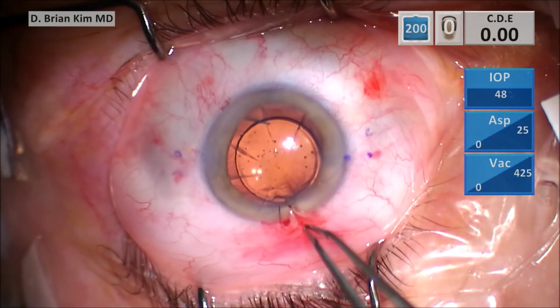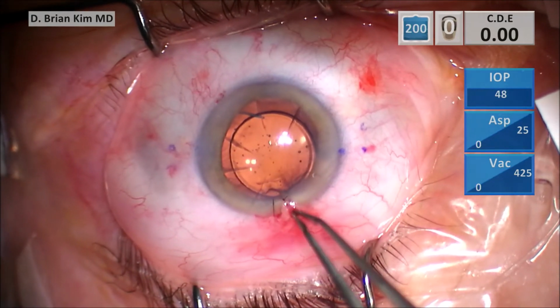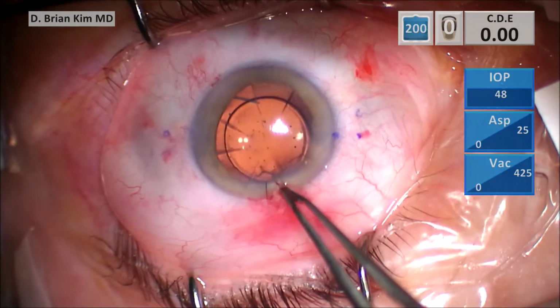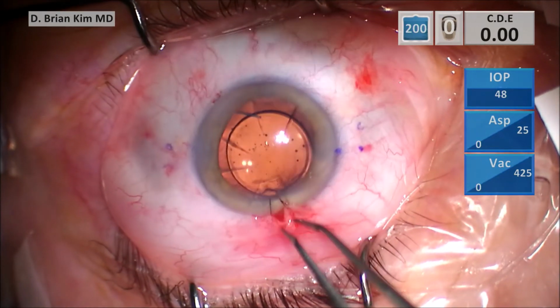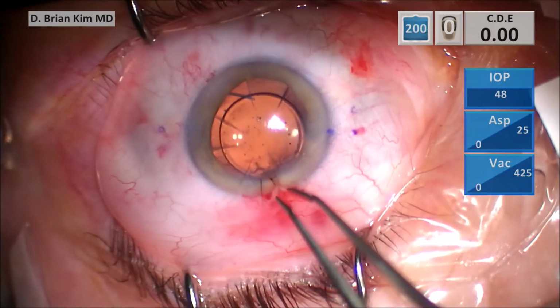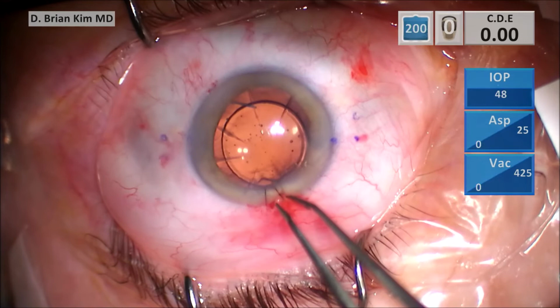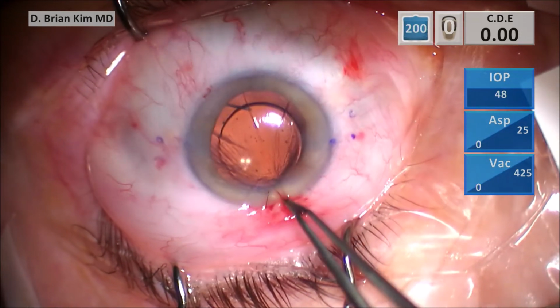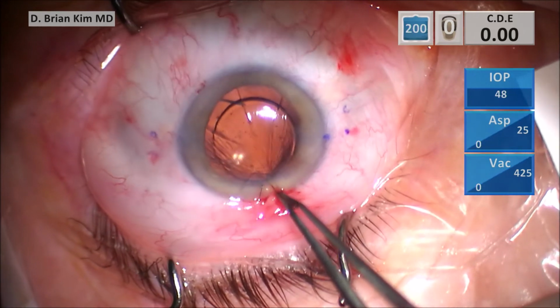So again, you had a dislocated lens, inferonasal. This is the left eye. I placed the trocar strategically. I placed the trocar right in the area of the hinge. And so that's a very important strategy in order to be able to levitate that optic up. So I placed the trocar over the area of the hinge where the zonules are actually still holding the lens because it dropped back vertically.